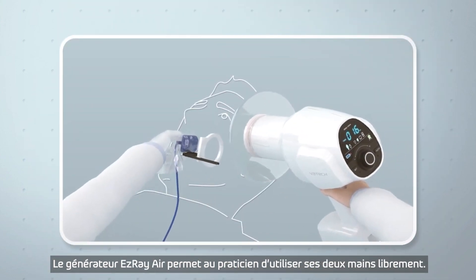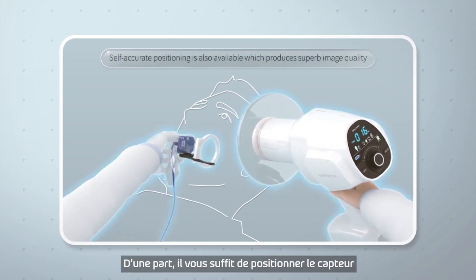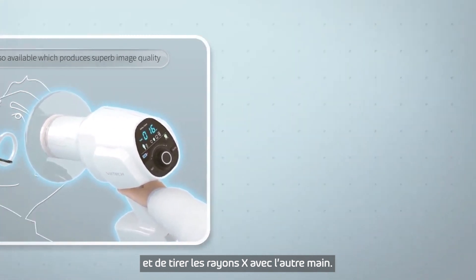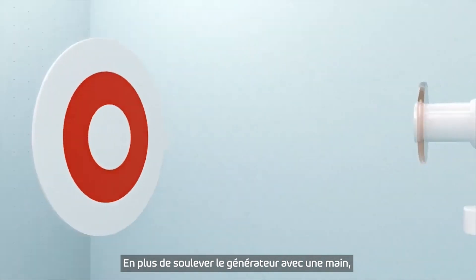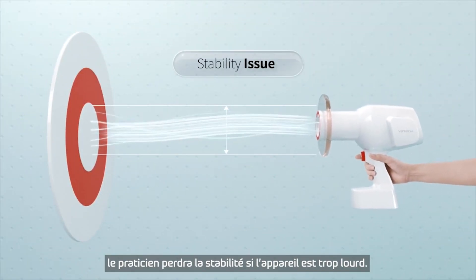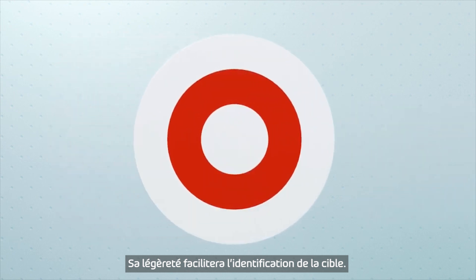EasyRay Air allows the operator to use both hands freely. On one hand, you can simply position the sensor and freely shoot the x-ray with the other hand. Regardless of lifting the x-ray with one hand, the operator will lose stability if the machine is too heavy. The lightness of the EasyRay Air makes it possible to pinpoint the target.